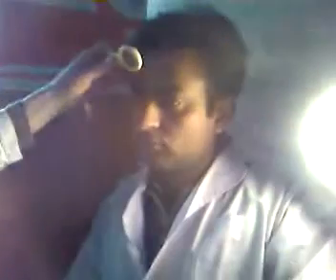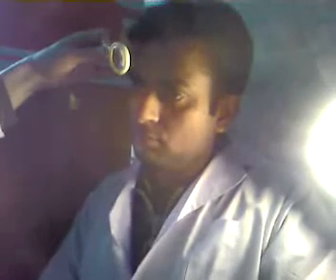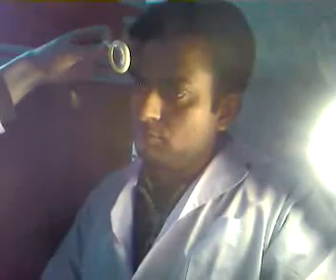You obtain a better view if you do this with a dilated pupil. With a narrow pupil and no experience, you will be unlikely to see anything.